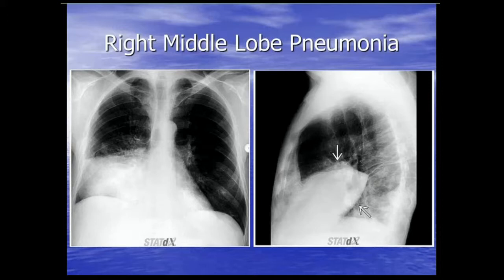This is a nice case of lobar pneumonia. There's significant airspace opacity in the right lung base. On the lateral, you can clearly tell it's in the right middle lobe. There's some bulging of the pleural fissures, and this ended up being a Klebsiella pneumonia.